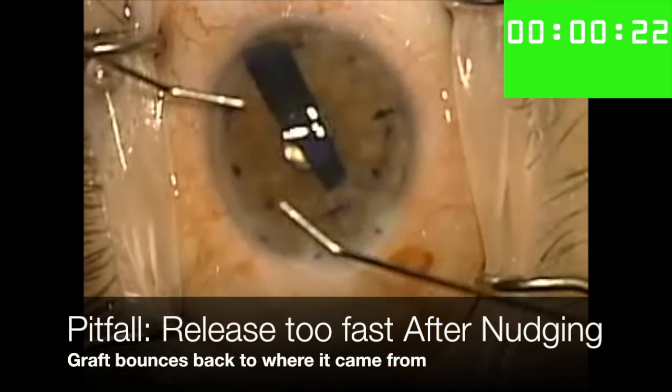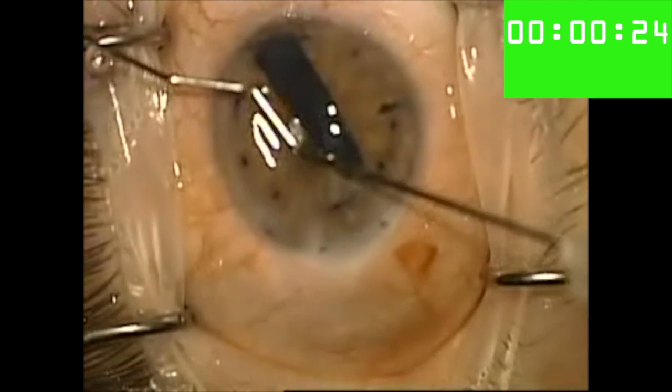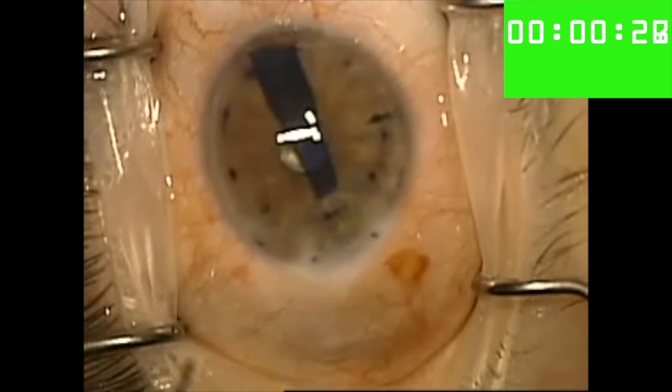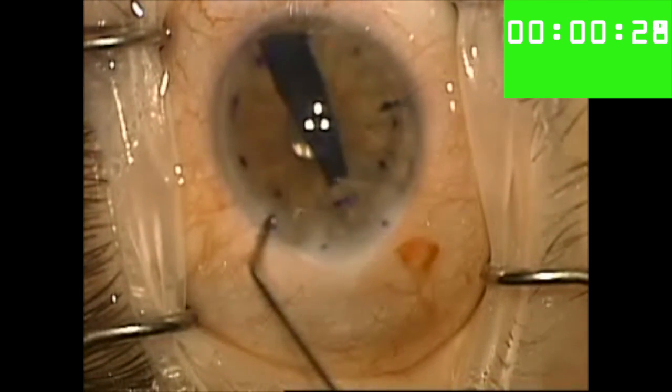Here you'll notice that I try and nudge the tissue to the shallow part of the anterior chamber, but I release too quickly which causes the tissue to rebound back towards my cannula. To prevent this from happening, it's important that you release slowly after you have nudged the tissue to where you want it to be.